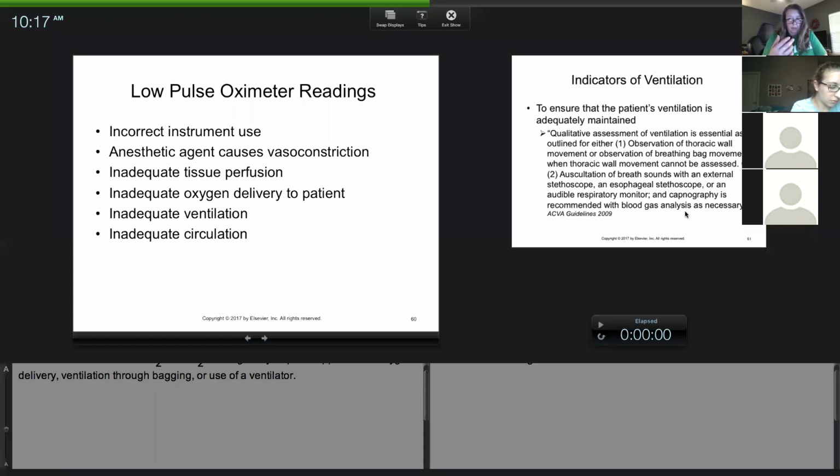It could be a collapsed lung. If the dog had a collapsed lung, then that lung is not perfusing. But do you see how I went through a checklist? The very last thing that I really cannot do anything with is that VQ mismatch. Then we have to get into more testing, potentially waking the patient up, potentially doing some radiographs after surgery, CT, you know what I'm saying? So does everybody understand kind of the flow?